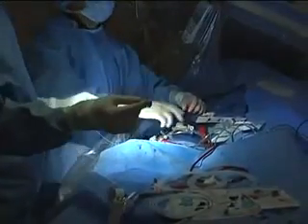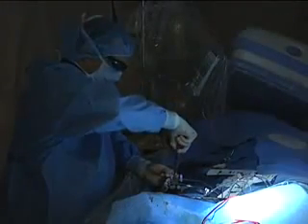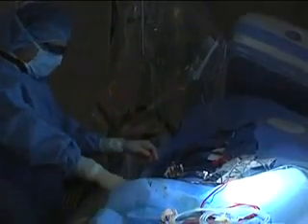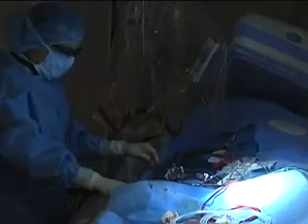The stent is in there and the balloon is inflating. We're now removing the deflated balloon. We use nitroglycerin to treat the vasospasm that can occur inside the artery when you're working in it. We're finished — both stents are deployed, the artery is wide open, flow is excellent, and his heart attack is aborted.